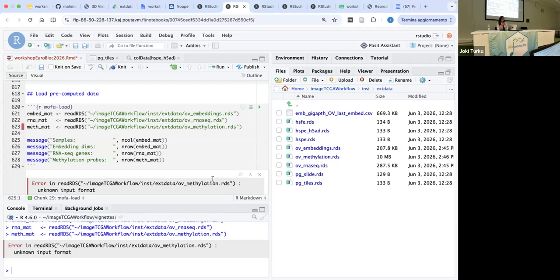Yeah, in that case, if you also have spatial resolution in your images, you can integrate the information. For example, if you have your spots and you know the expression of your genes for each spot, you can match your spots with the tiles from Prov-GigaPath and then correlate the gene expression with the embeddings. But with the TCGA data, there is no spatial resolution at all. We are also trying to simulate it using some foundation models, but we are not sure about the result because they also give us expression where there is no tumor or tissue. So that's kind of weird and not trustable. But yes, you can do that if you have your own data.